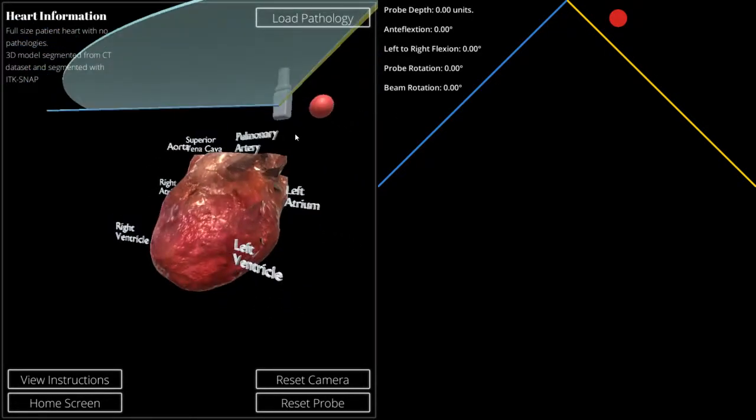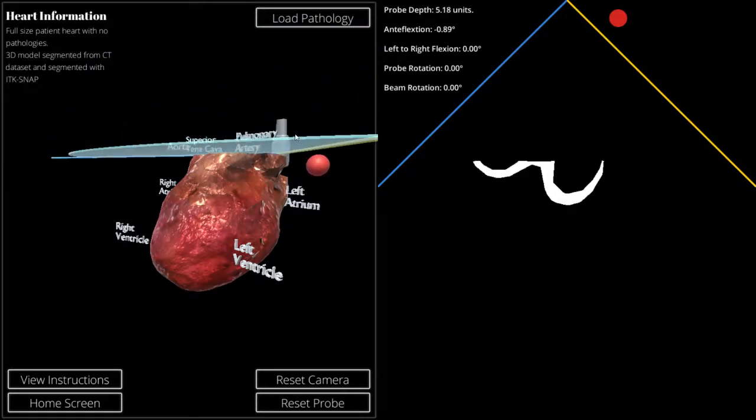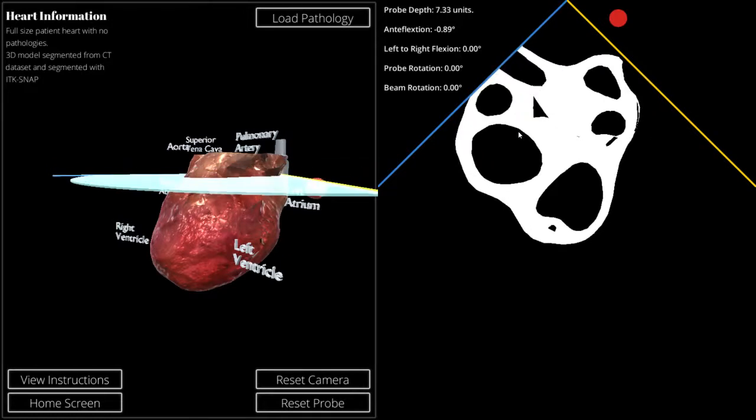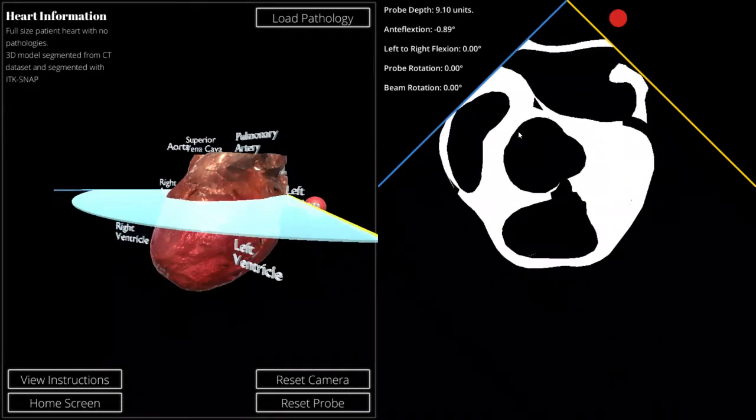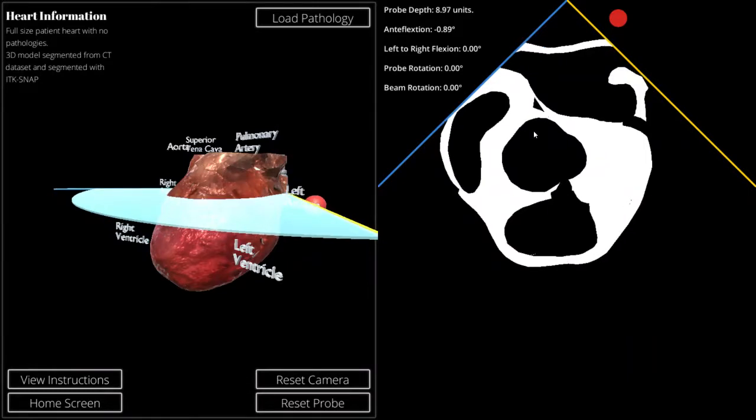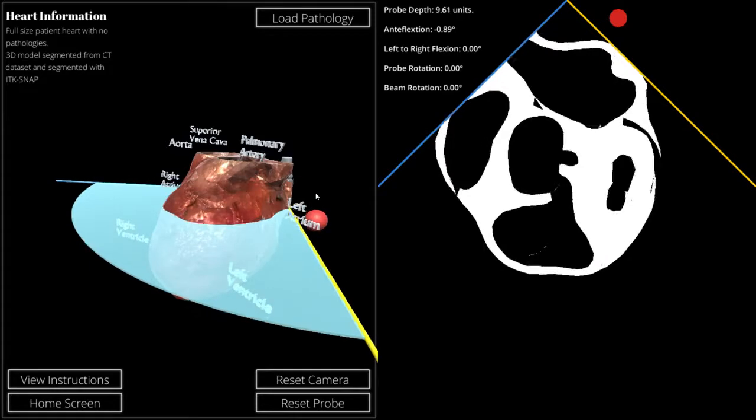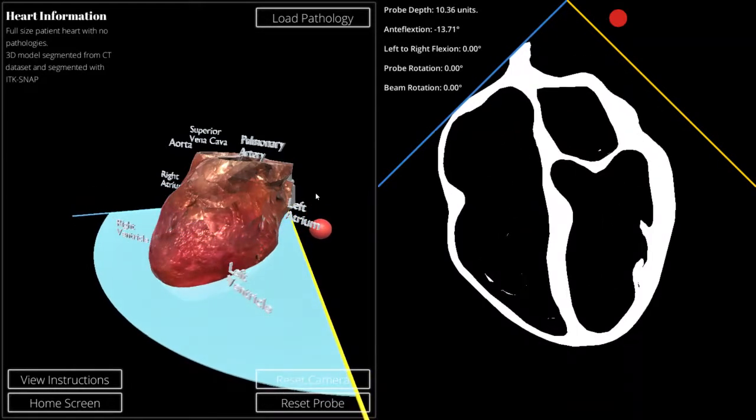As we go down, we can begin the exam. So there's the pulmonary artery. We can also see the start of the ascending aorta. Going down a little bit further, we get our short axis views, which are completely clean because in this case, there's nothing behind the heart.